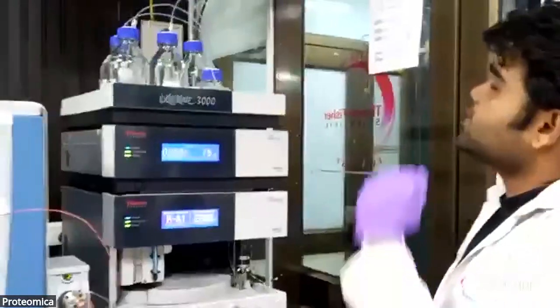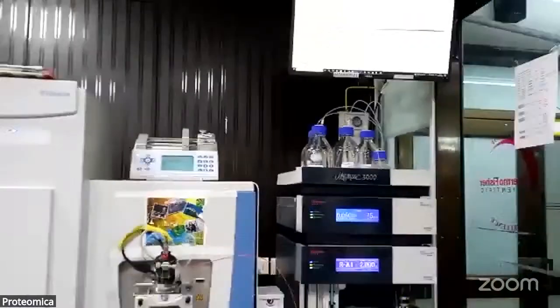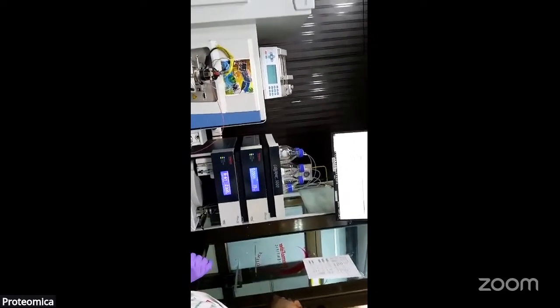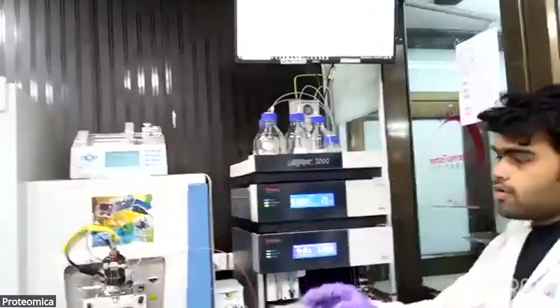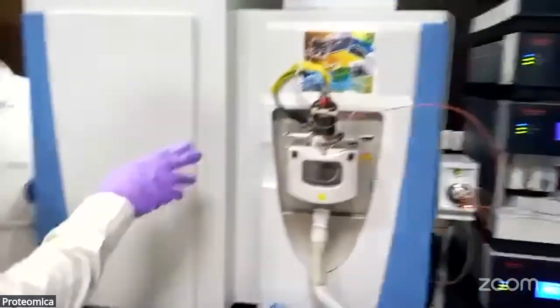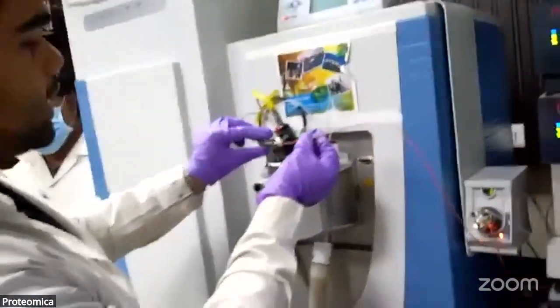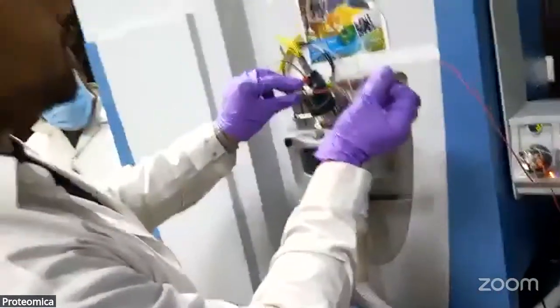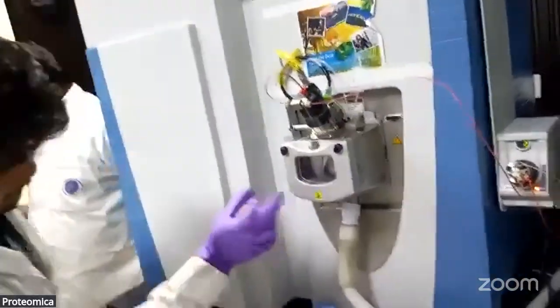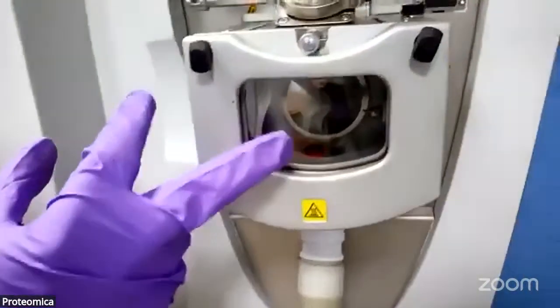You can see the model of the targeted metabolites, where you can see specific fragments of your interest of metabolite will be coming in the model. So now, one short demonstration with the mass analyzer. From here the solvents, the solution and samples will come, and on the inside you will see a sweep cone here.